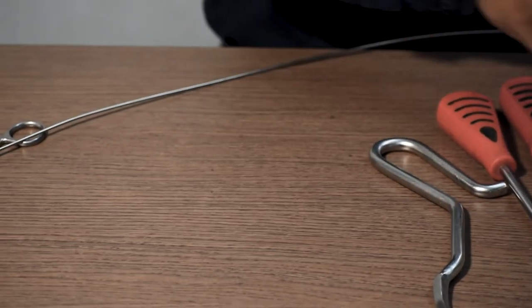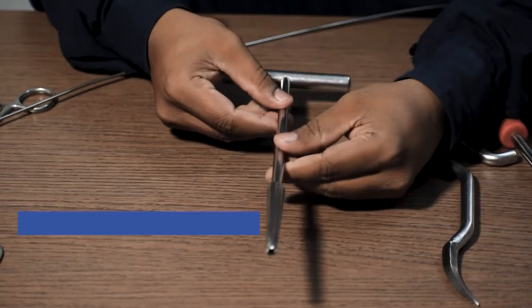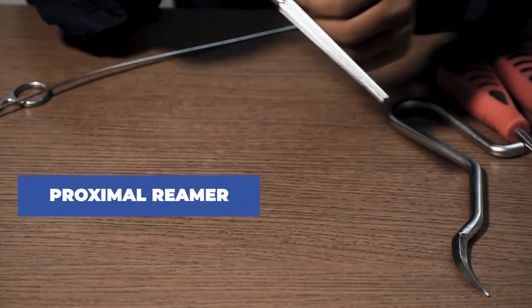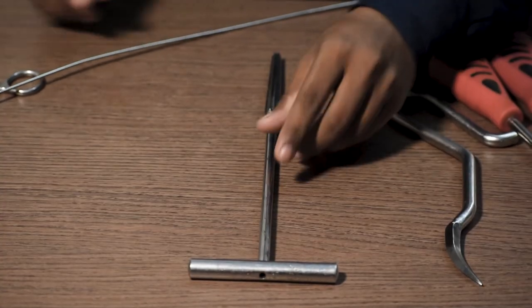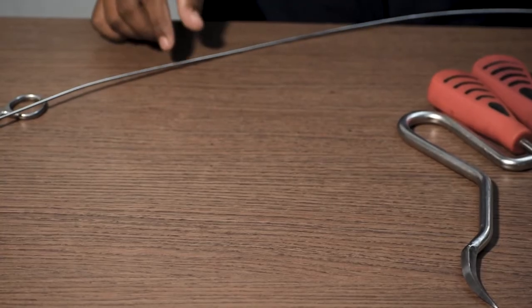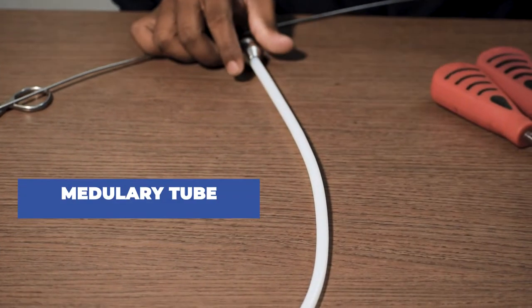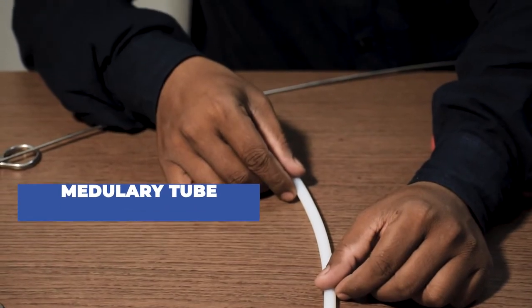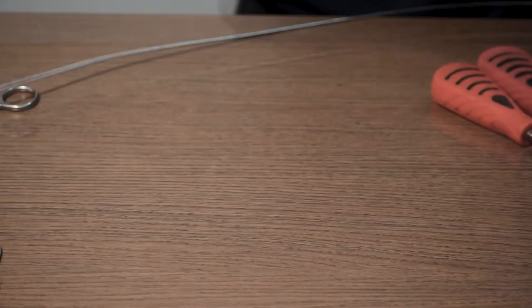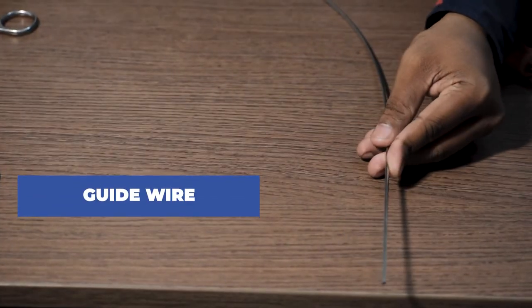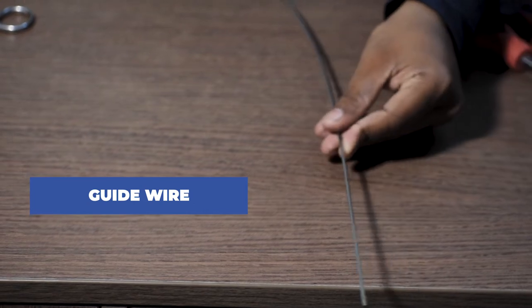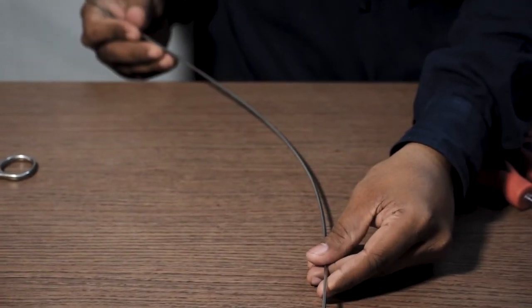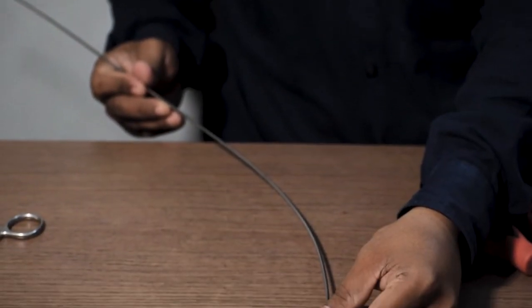After that, this proximal reamer is used to do further reaming. This device is called a medullary tube and it is inserted in the canal after the reaming is done. After that, plain guide wire is inserted in the canal and the medullary tube is taken out, and it stays inside the canal till the time the nail is completely in.